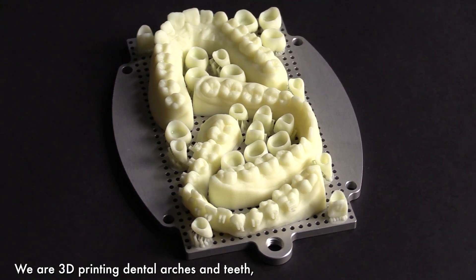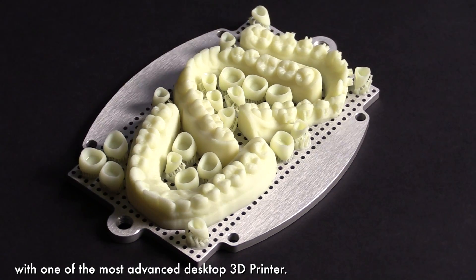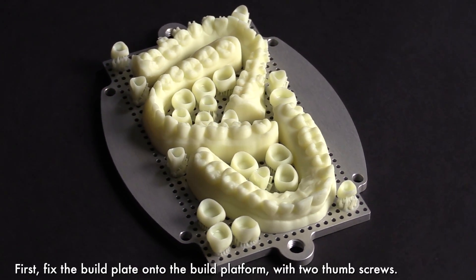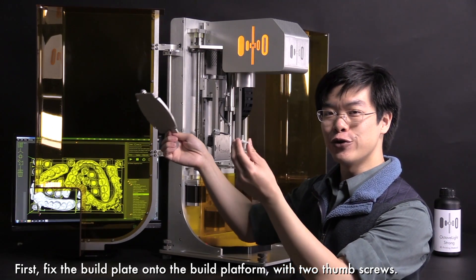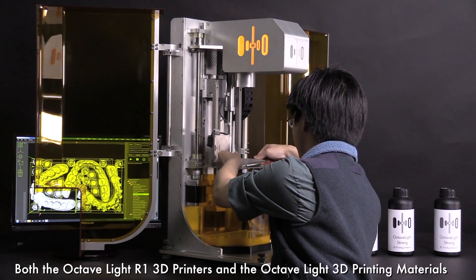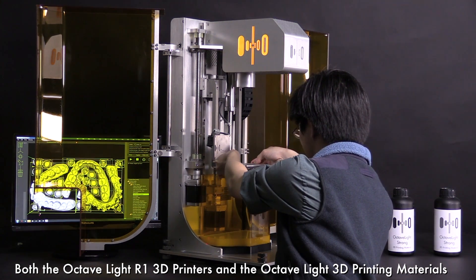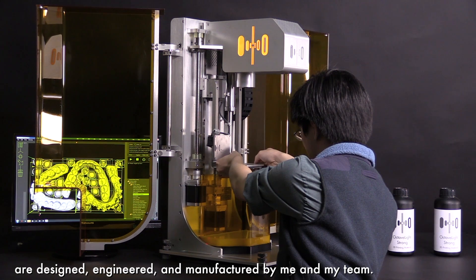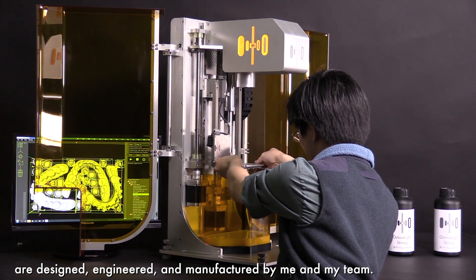We are 3D printing dental arches and teeth with one of the most advanced desktop 3D printers. I'm Charles Lowe. Both the Octave Light R1 3D printers and the Octave Light 3D printing materials are designed, engineered, and manufactured by me and my team.